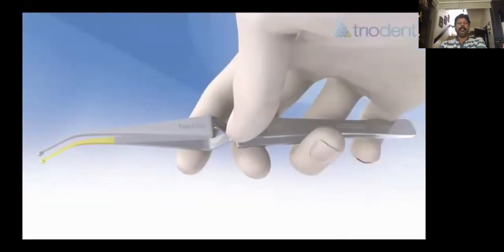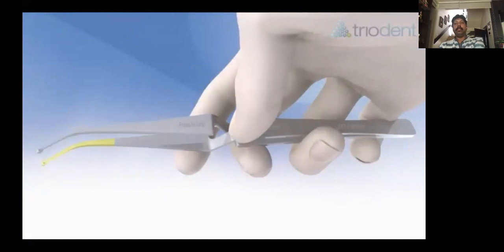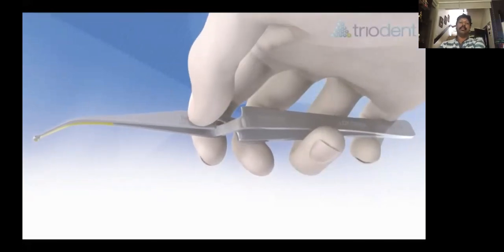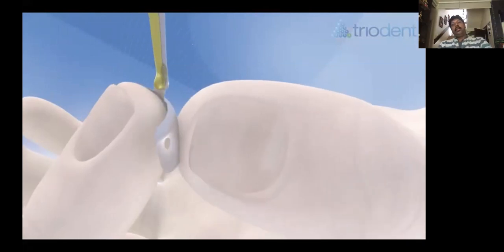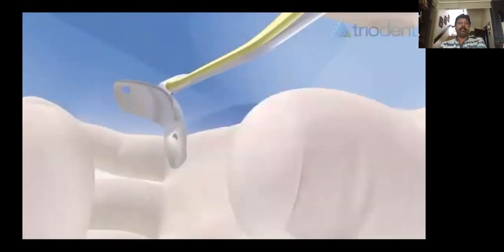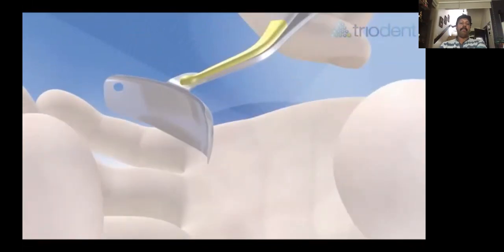Press Triodent pin tweezers at the back to open or to release an object, and at the front to grip. In their passive mechanical position, the tweezers will hold wedges and matrices securely. Hold the appropriate V3 matrix with the pin tweezers and bend the tab towards you, creating a contra angle that ensures easy matrix placement in an apical direction.